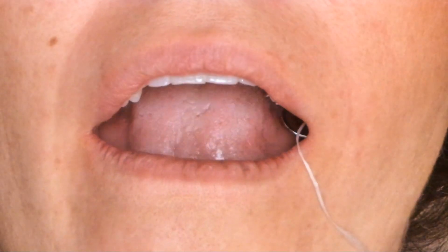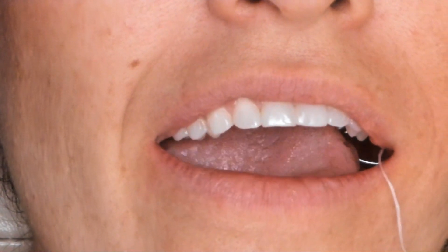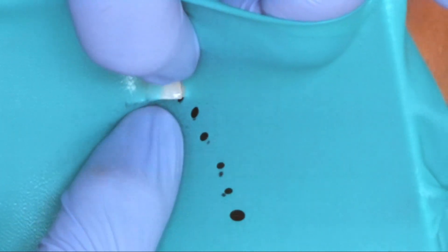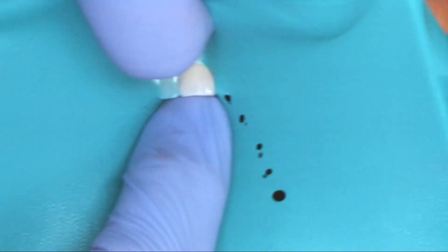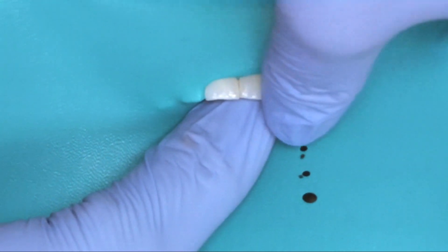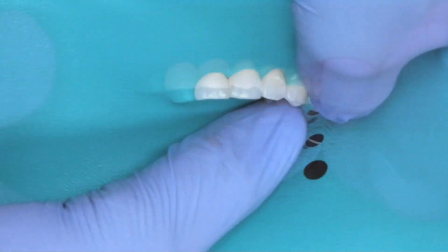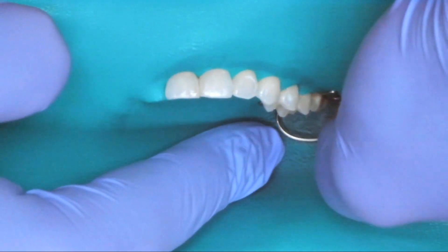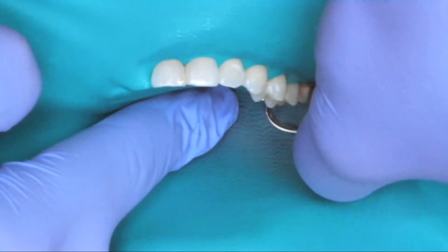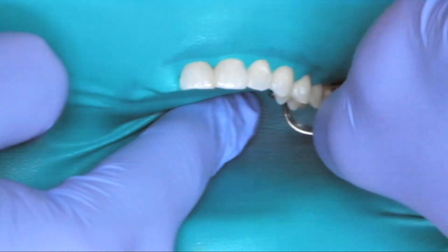As you can see, there is no bleeding, the clamp is very stable, and the patient is comfortable. I prefer to start with anterior teeth and work my way towards the back one tooth at a time. I find that this technique makes this process more predictable and secure. If I get caught up on any tooth, my assistant helps with floss to lock it into place. Once the dam is secure, I use a flat instrument to help invert the rubber dam and prevent any salivary leakage. As you can see, we achieved an awesome barrier that helps protect the throat and isolate the teeth.